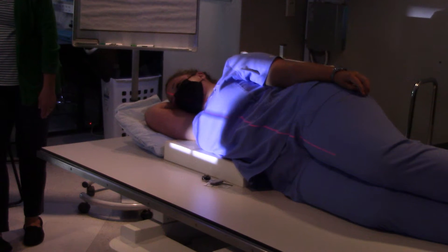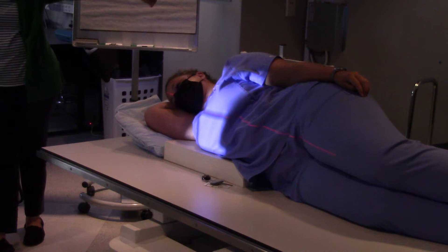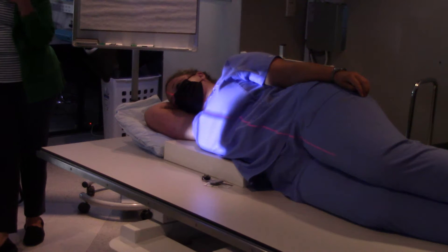I got it centered down in the middle of her neck. Now we have to collimate — we definitely don't want light on the wall. If you see light on the wall, it means your collimation is open too much. It's especially important for decubitus patients — you don't want light hitting the wall because there's no patient there.